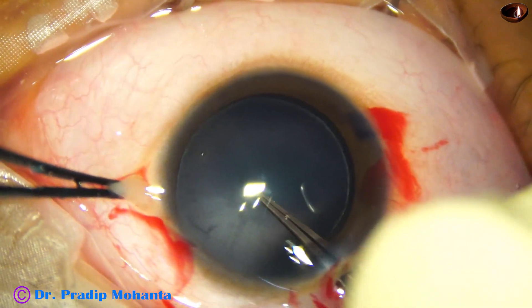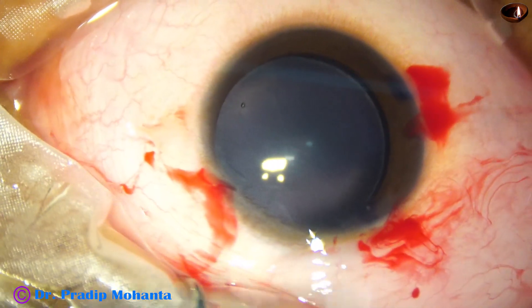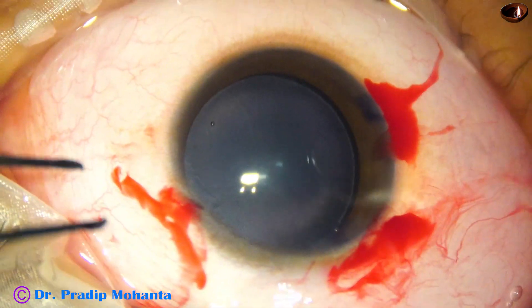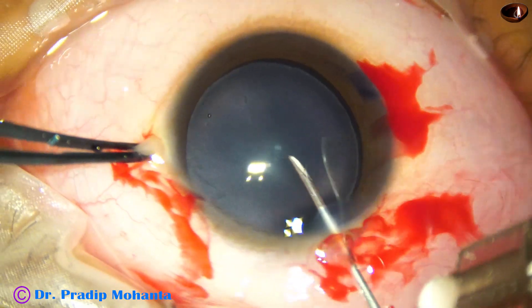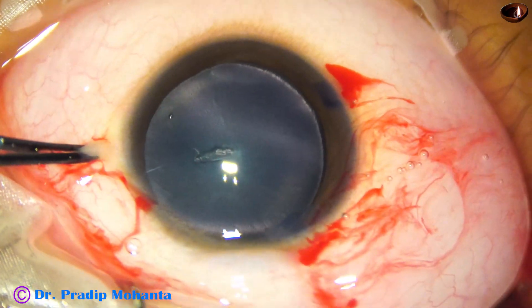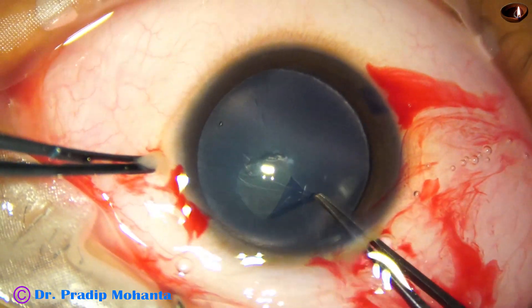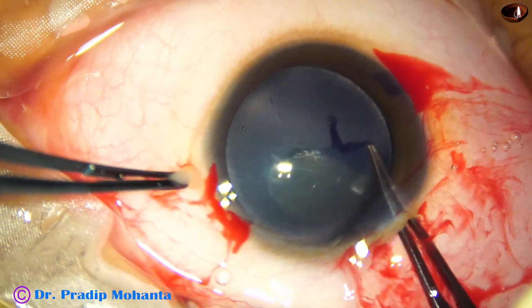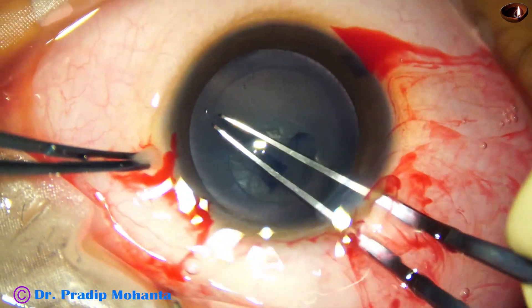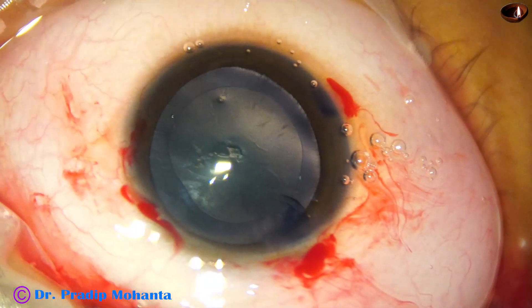I could not make a puncture on the anterior capsule with Utrata forceps. In pediatric cataracts it is really difficult. So you have to take a sharp needle, cut, and make a capsular tag. Guide this capsular tag all around and do a rhexis which is about 5.5 millimeters in size.